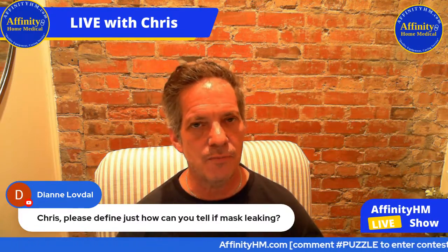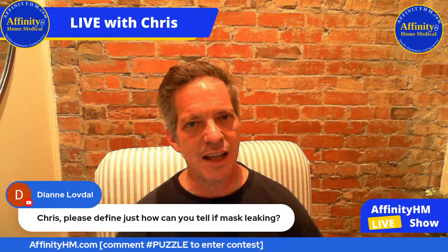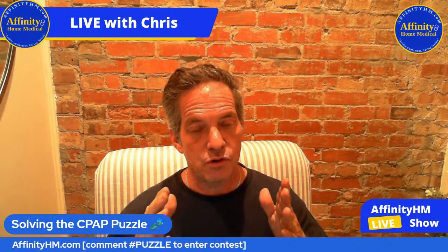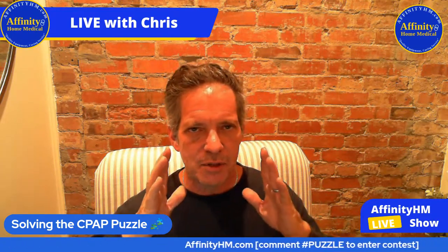Another really good thing to do is actually test out your mask system as you sit down on the side of the bed. It's time to go to bed. Sit down on the side of the bed and put your mask on, turn your machine on. Put it on kind of loosely initially, I recommend. And then with your machine on at your prescribed pressure, just gradually tighten the mask up little by little, evenly, until the leak stops. One more step. When the leak stops, turn your head left, right, look up, look down. And you may spring a leak at that point. If so, tighten it up just a little bit more. And that should be perfect for sleeping right there.